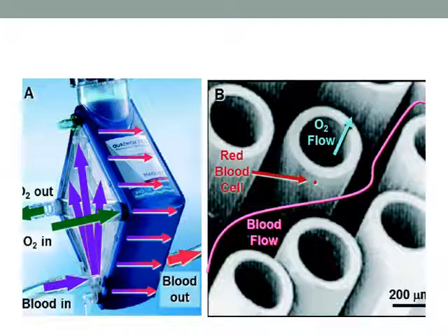And the reason that this works with low flow, low pressure, is because the blood goes around these tubes rather than through them. The pressure or resistance that it takes to go through a tubing is very much a function of the diameter of the tubing. And these tubes are very small. This says 200 microns across, a very small tube. If you try to put blood through tubes that size, pressure is enormous, and we wouldn't be able to do it. But air goes through that very easily.